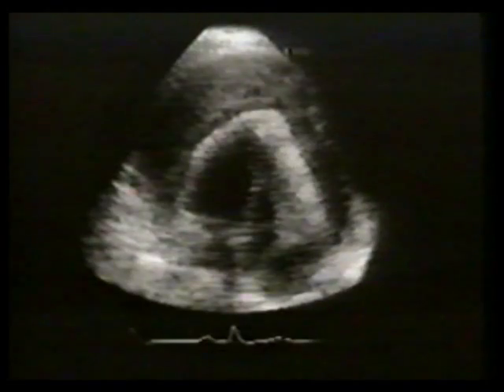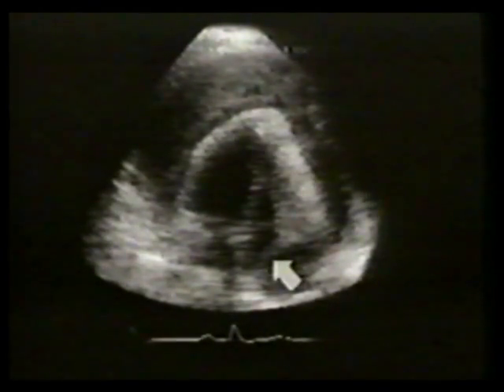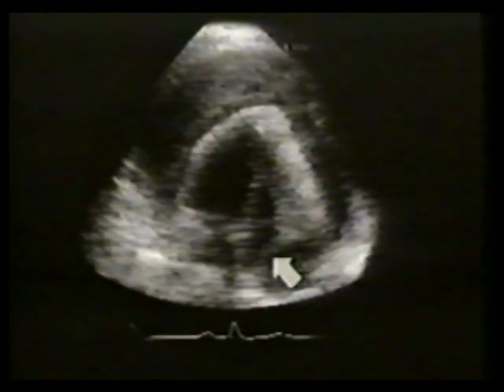In apical four-chamber format, the shaggy epicardial border and the clumps within the pericardial fluid are more apparent. In real time, you will see the right atrium collapse in diastole, another 2D sign of tamponade.